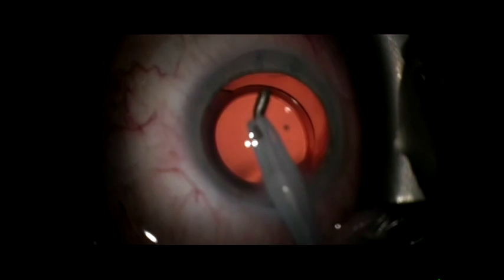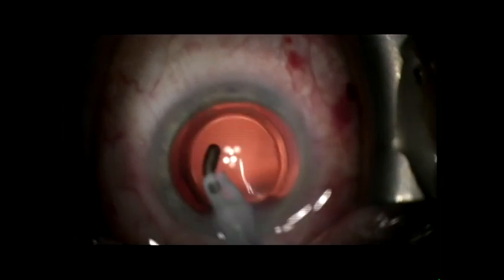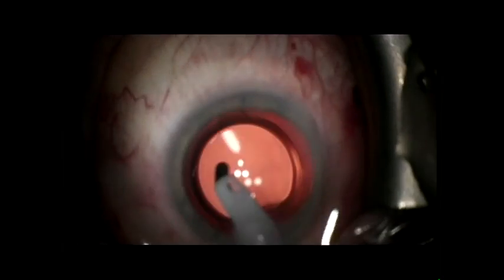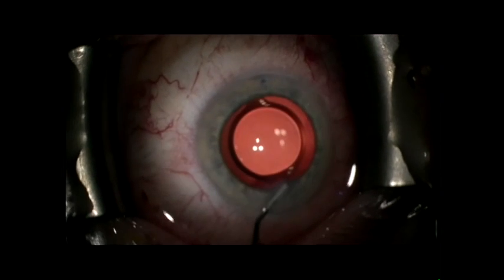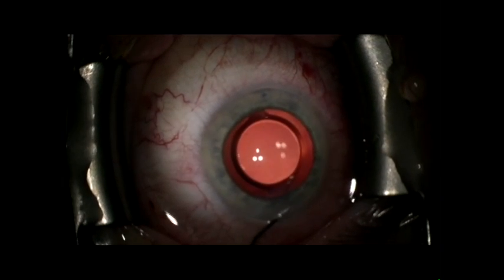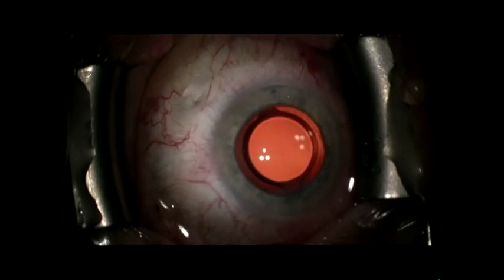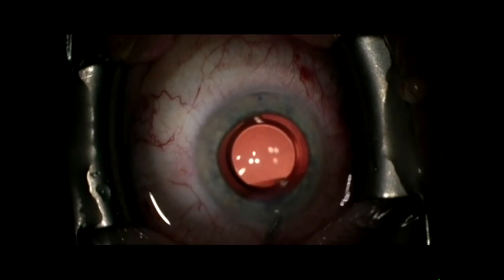It is important to remove all the viscoelastic so we don't have an additional pressure spike, as some of the Helon will remain in the canal and the distal collector channels for up to 24 hours. I also treat the patient postoperatively with Diamox and also HS if they are not allergic. It is my routine here to hydrate the incision with vancomycin, which helps seal the wound but also helps introduce antibiotic to the wound site and protect the eye.